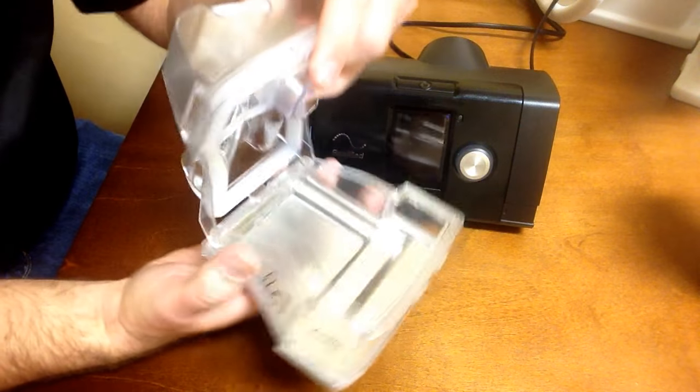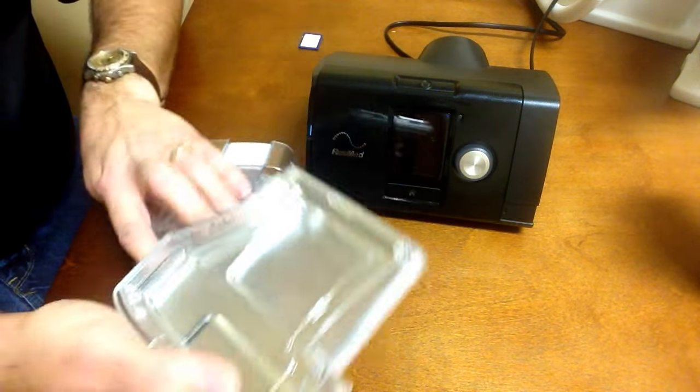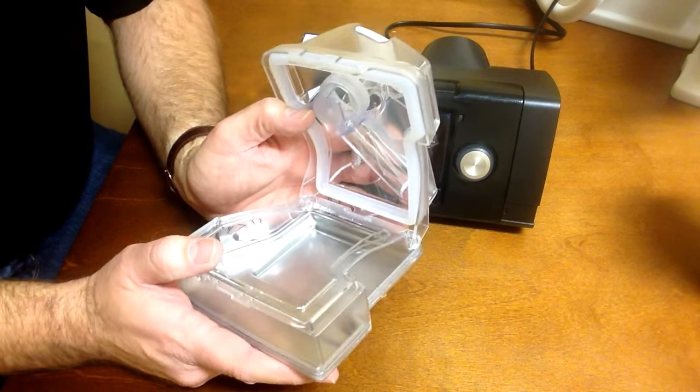There are fill lines, and this also works well for cleaning it. The top does come off with these tabs here for better cleaning of your humidifier chamber. A mild dish soap or a mixture of vinegar and water are good choices; harsh chemicals are not recommended.